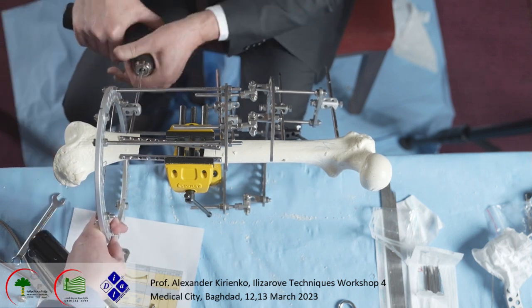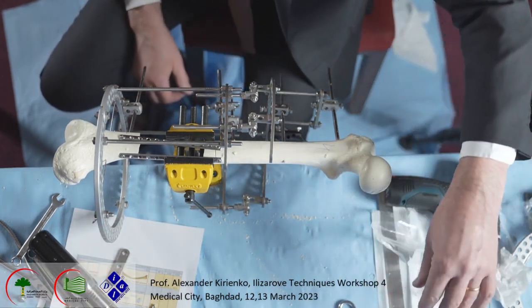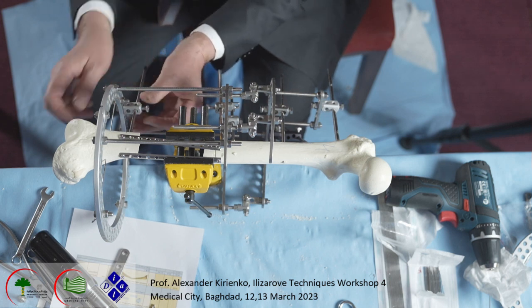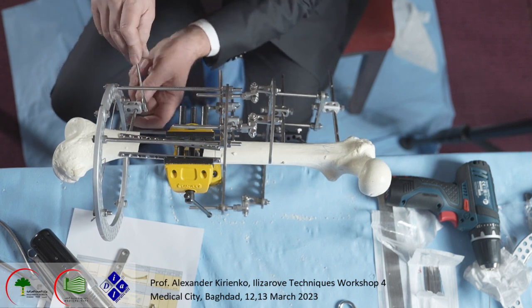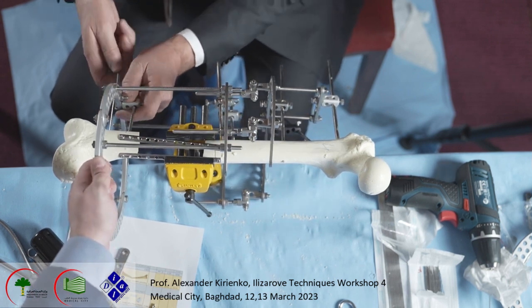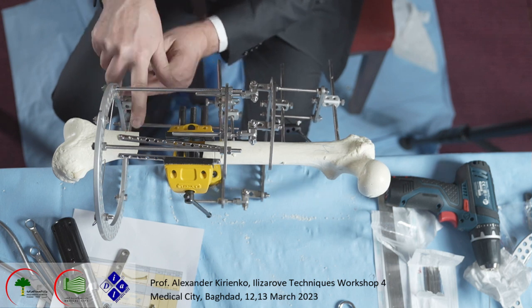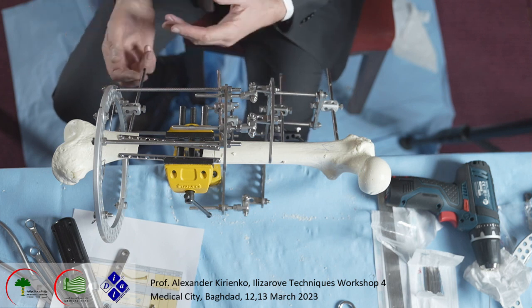And when you put the half pin, fix it with a small bolt or medium bolt. Just more stable, the system. Each time you introduce one wire or one half pin, control the flexion of the knee. Because in this way now, you flex the knee. If the patient has difficulties, it's better to cut around this half pin a little bit, to cut the fascia, and in this way the patient moves the knee.